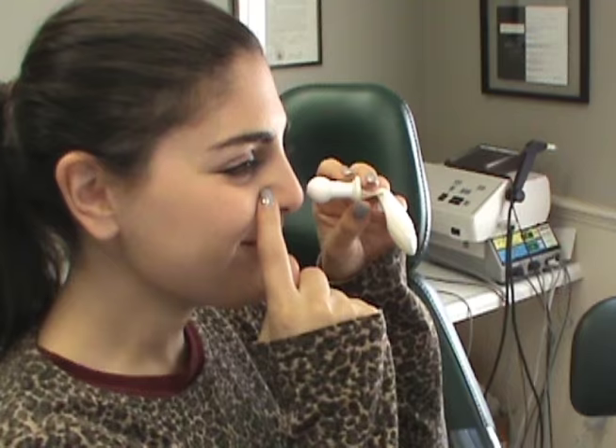Close the other nostril. Let the air start flowing and swallow. That little burpee sound you're going to hear — that's normal. How'd it go? Worked. Good.